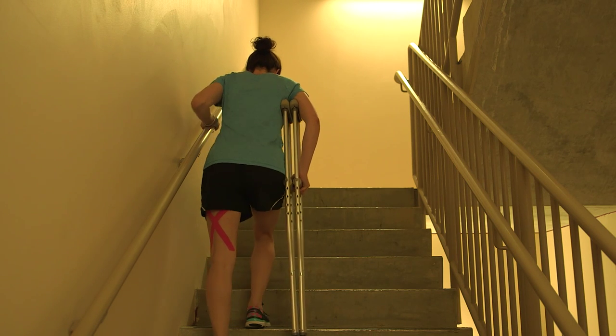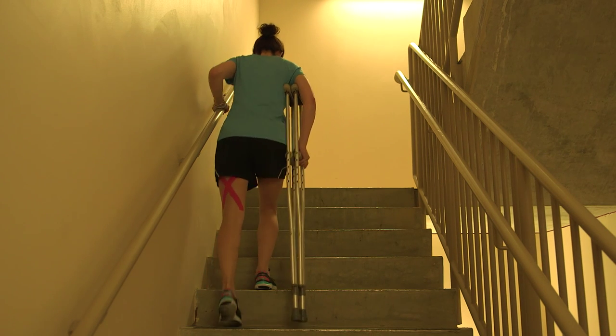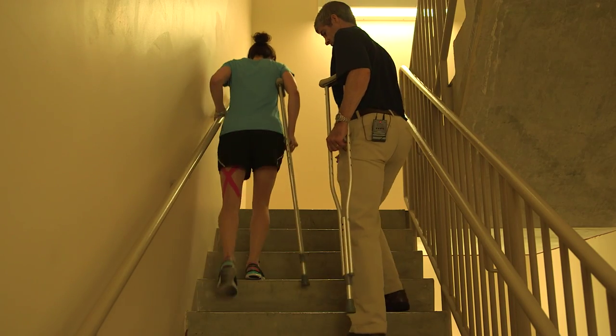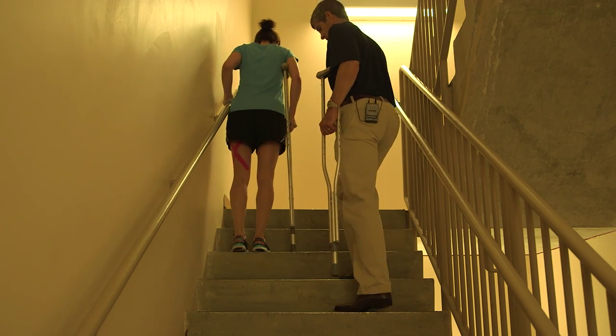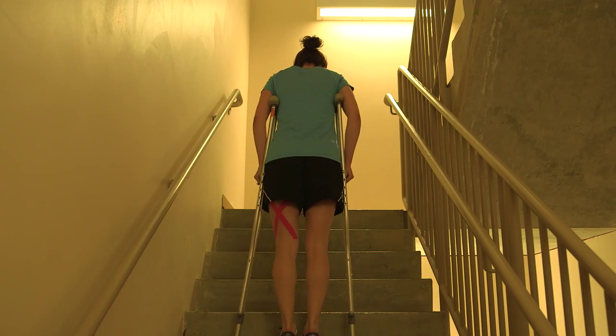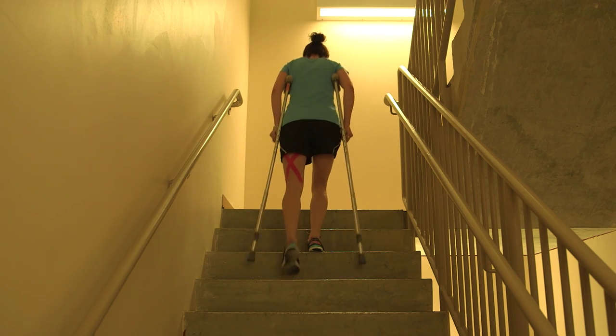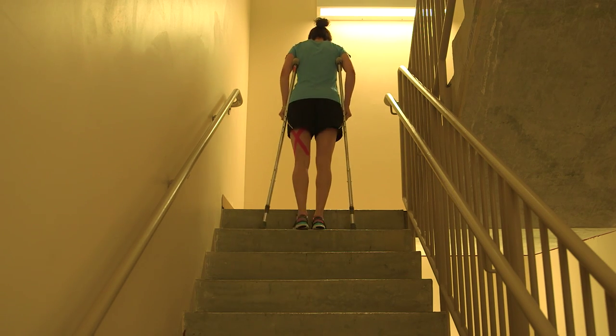To go up the stairs, start with your good leg and then bring your surgical leg and your crutches next. You may use a handrail if available. Either give one crutch to a friend or place both crutches together under your arm. You may go without a handrail using a crutch under each arm as shown. This is also useful for going up curbs.